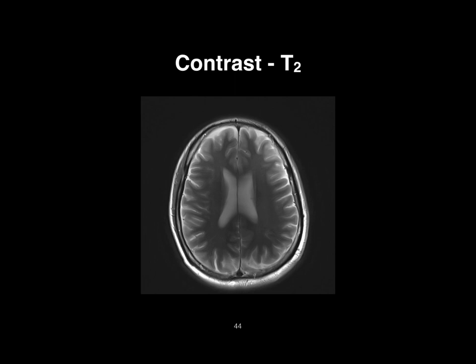Questions? Yes? When you say it has a longer T2, are you saying that it takes longer for them to get out of sync with each other? So yes, a longer T2 does mean it takes longer for the signal to decay away. Yeah. Thank you.